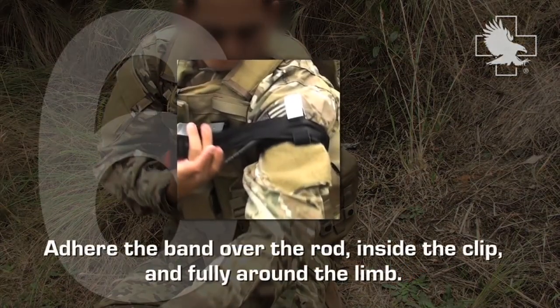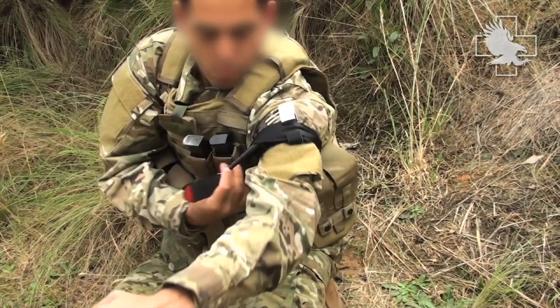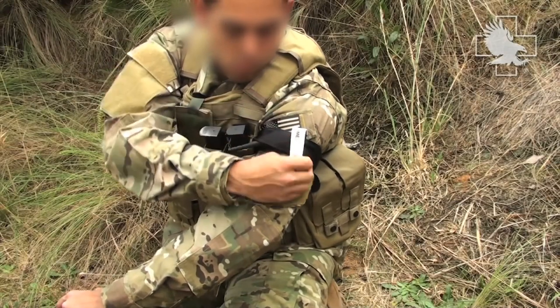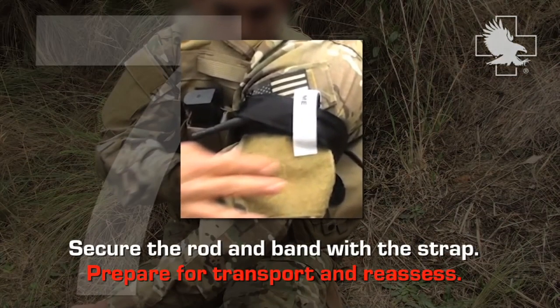Adhere the band over the rod, inside the clip, and fully around the limb. Secure the rod and band with the strap. Prepare the patient for transport and reassess.